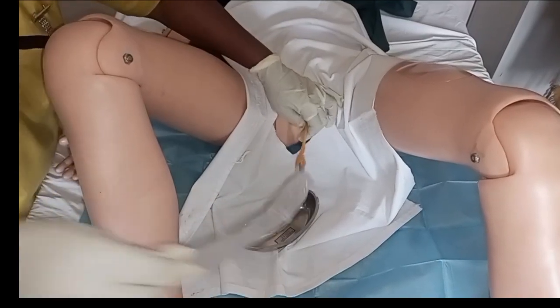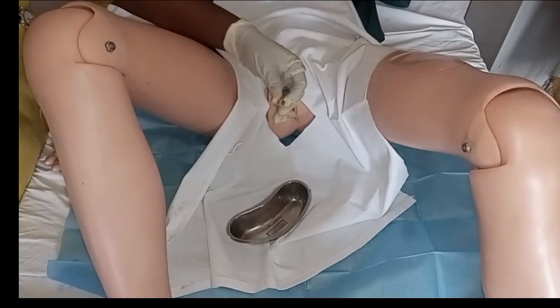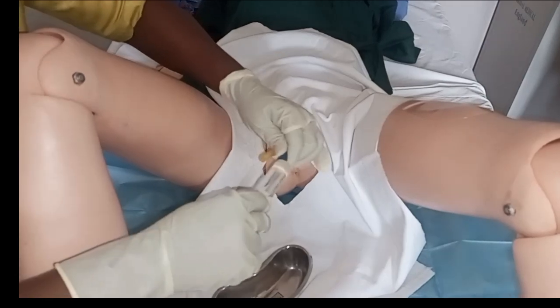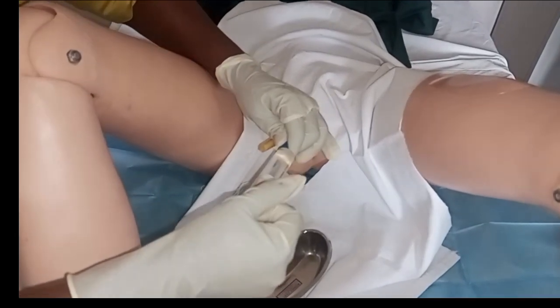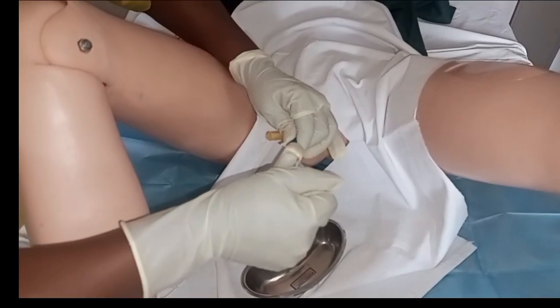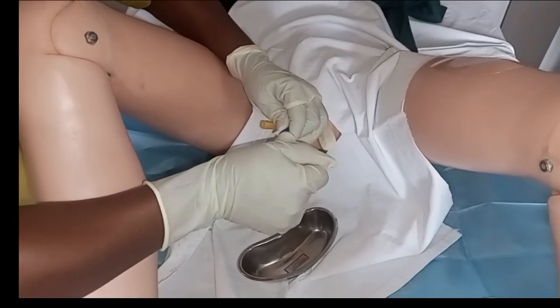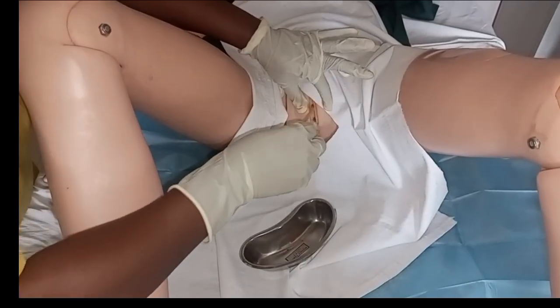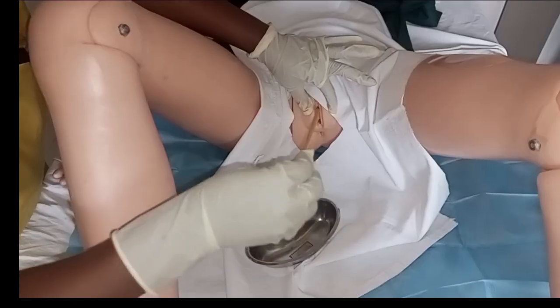We have now inserted the catheter. Remove the plastic cap and inflate the balloon. I am using 10 to 15 mls of sterile water to inflate the balloon of this catheter.